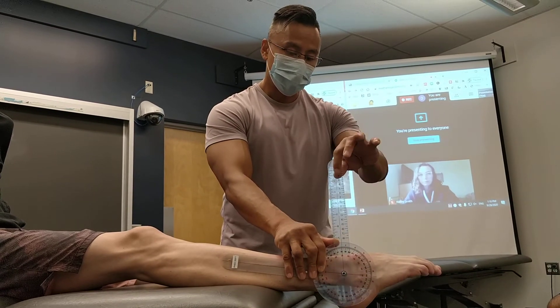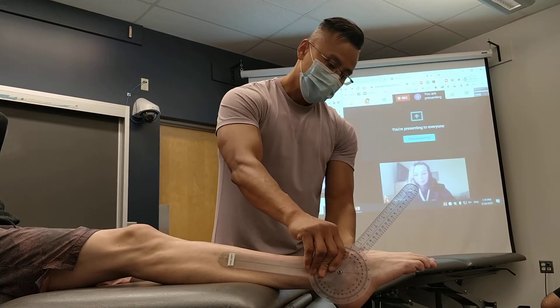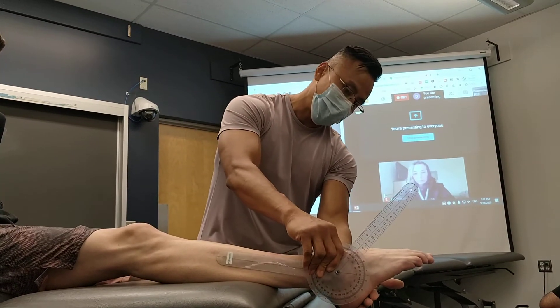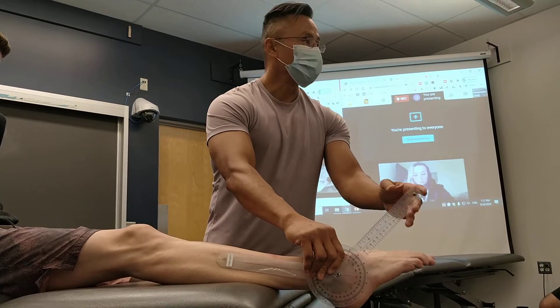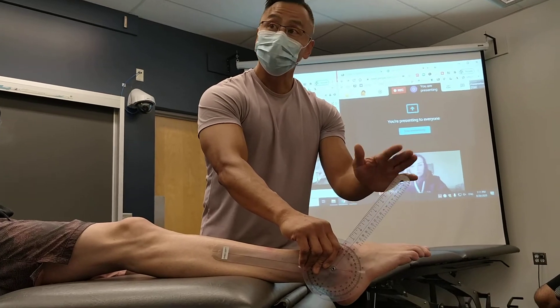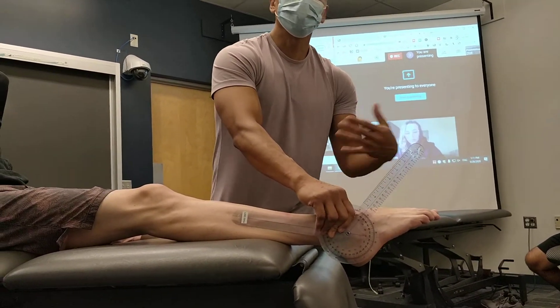So plantarflex — same idea. I'm just going to follow, and it's not on the base of the fifth, but I'm making sure it looks sort of parallel to the moving arm. Because this is not on the base of the fifth, I'm trying to keep it parallel to the calcaneus. So that's the other way to do it.